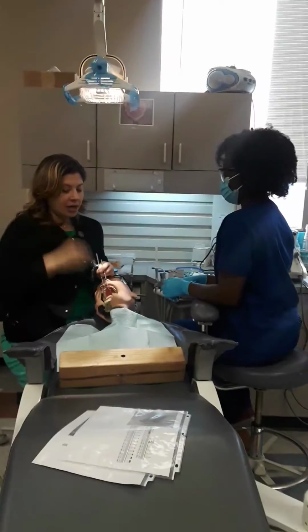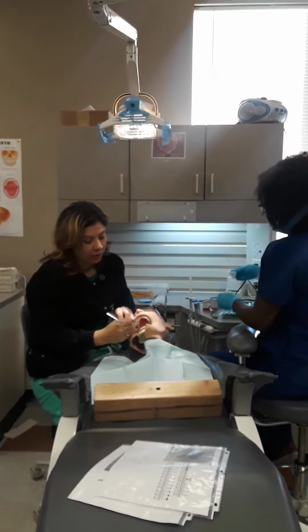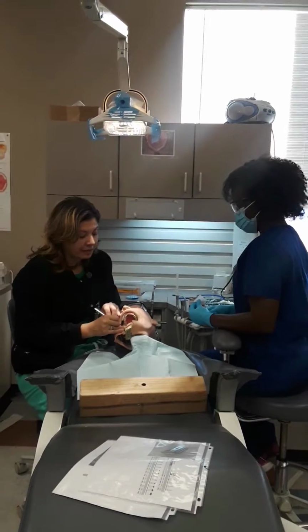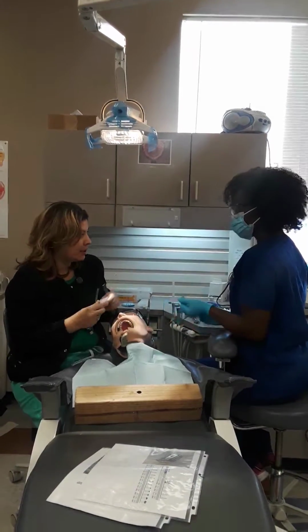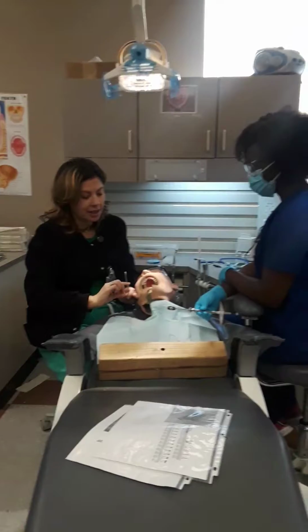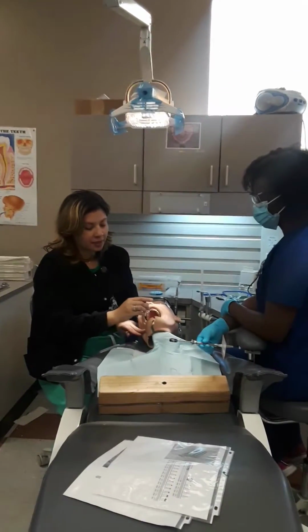The first thing you want to do when you pass this to your doctor is verify we are working on whatever tooth we're working on, making sure decay's present, making sure that he actually treatment planned everything correctly, which he did, I'm pretty sure. So she's passing me now my topical gel and some gauze, because we're going to start getting him numb. My gauze is to wipe the saliva from the inside of the cheek, and depending if we're working on upper or lower is where I'm going to wipe.